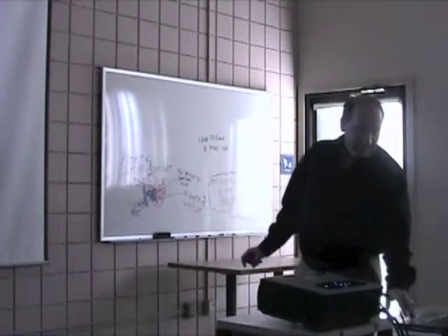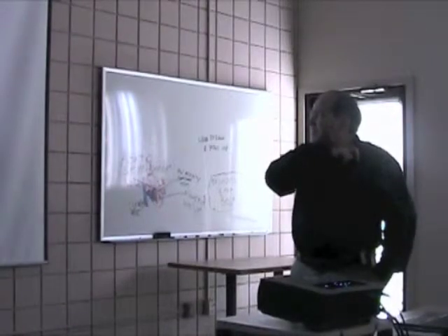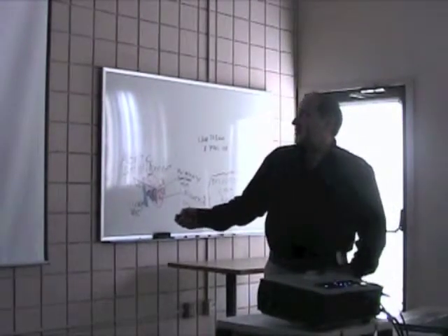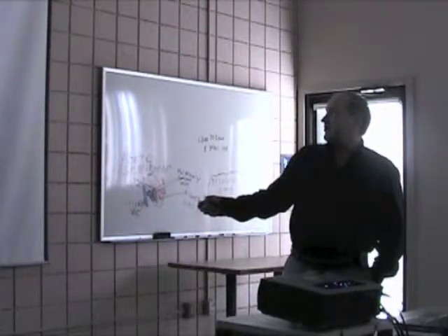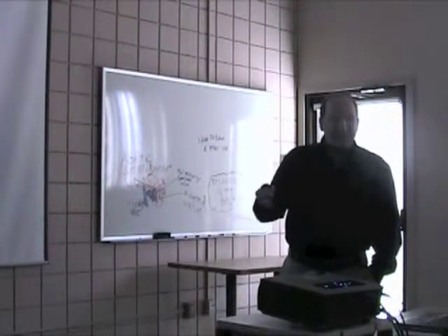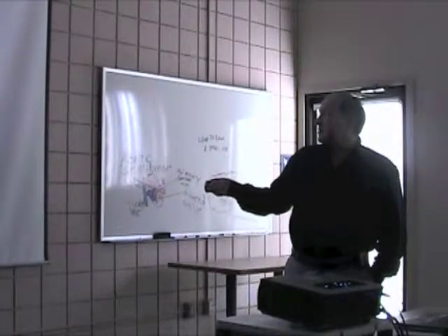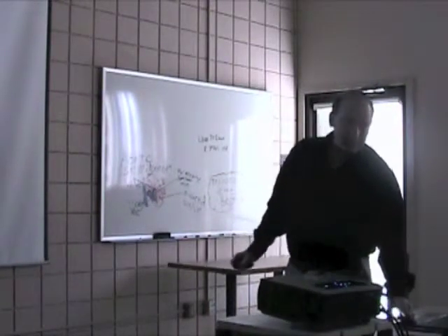In the 1980s, there were refinements to prosthetic heart valves. There were advances both in the mechanical valves and in the tissue valves. And the Hancock valve, I think I showed you that, was developed in the 1970s. Over time, they learned to treat these with different medications that prevent calcium formation over time, because these big valves tend to calcify, they tend to block off over time. And currently, these are the ones, the 3rd generation pig valves that we use. This is Medtronic. This is one of the companies that makes them. Mosaic and Freestyle valves are the ones that we use most commonly here.